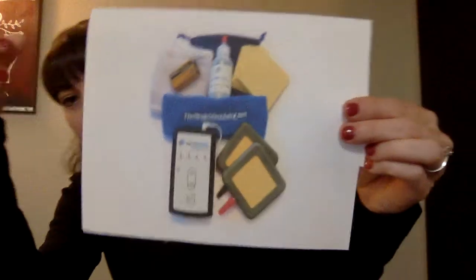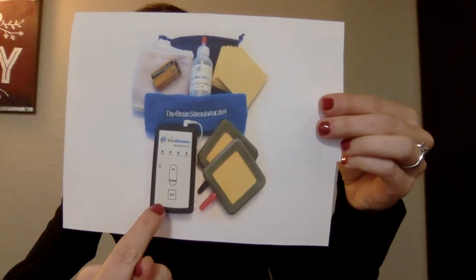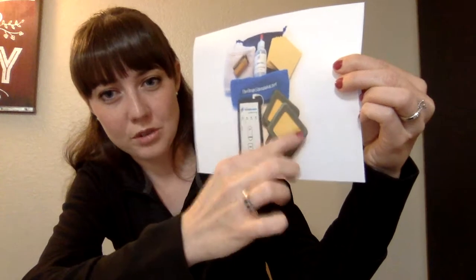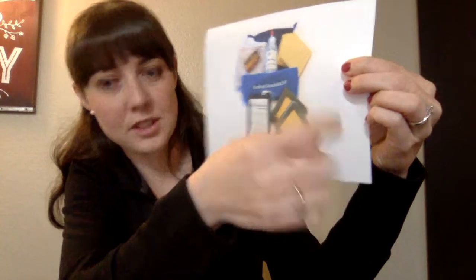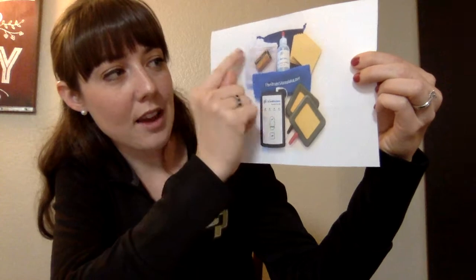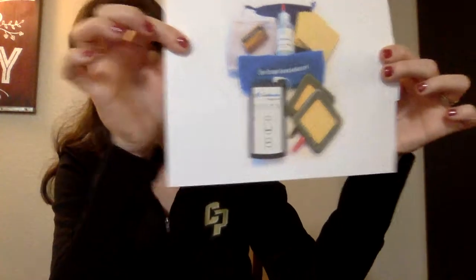So in this image, you will see the tDCS device, the cable that goes to the electrodes, the actual electrodes themselves, replacement sponges, which are right here, that go with the electrodes, the electrode placement headband, and another headband, a saline solution bottle, and a battery which powers this device. So this is everything that you will need for tDCS. And again, these headbands are electrode positioning headbands.